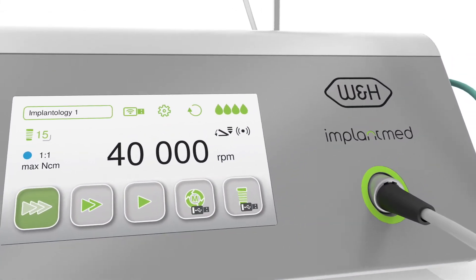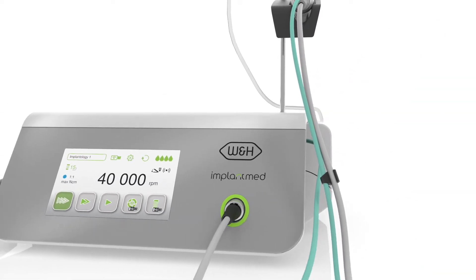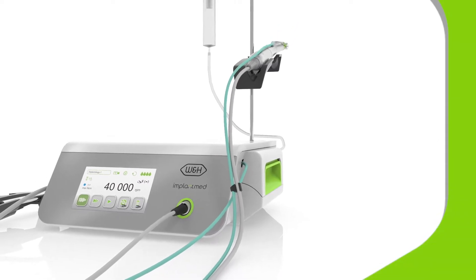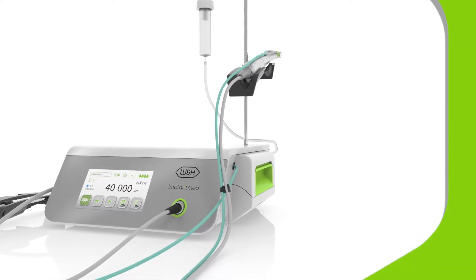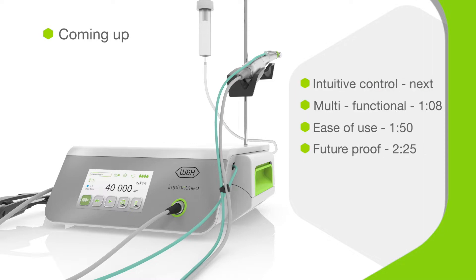Meet the ImplantMed Plus from W&H, relied on by oral surgeons all over the world for implantology and much more. This fourth generation system offers improved safety for you and your patients. The choice of customization options and control methods lets you fully optimize the system to suit each treatment. And ImplantMed Plus even comes upgrade ready, so it's fit for the future.